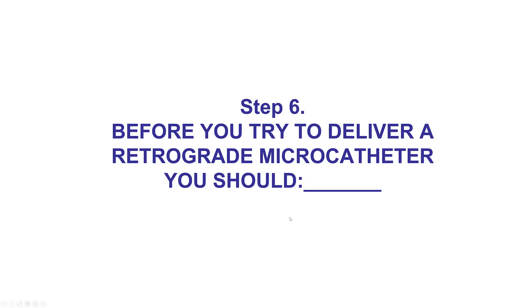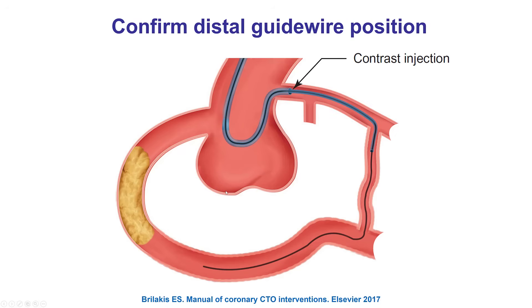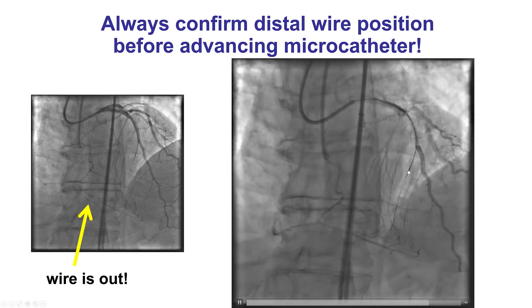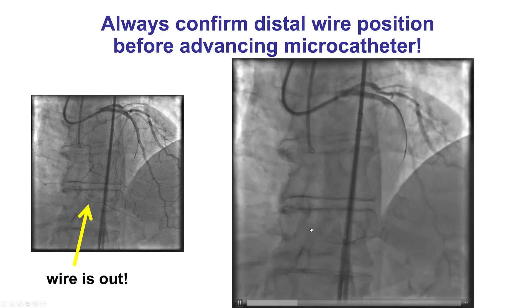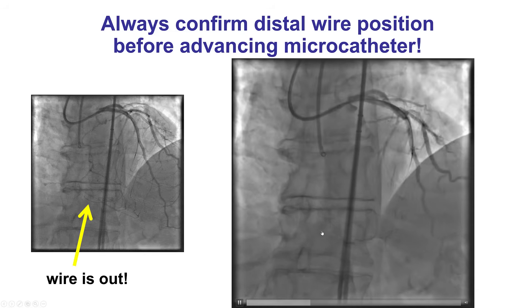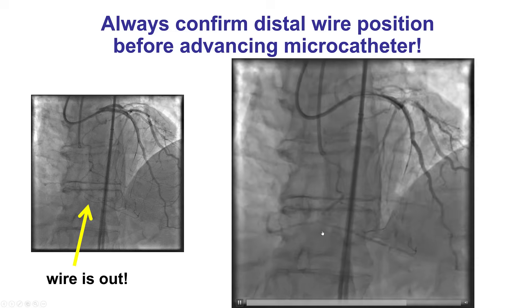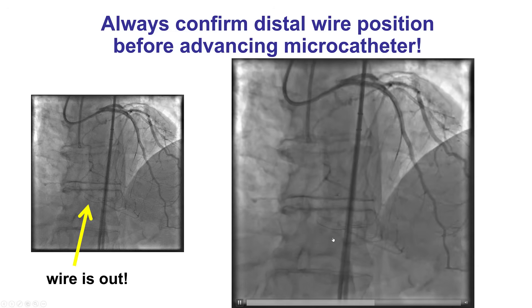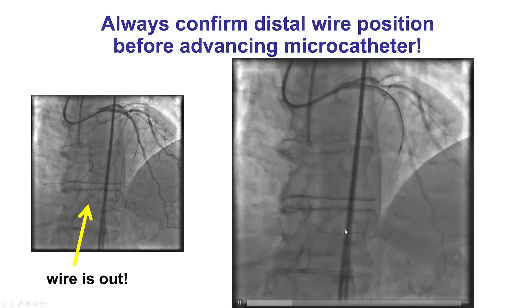It is very important, before doing anything in terms of delivering the retrograde microcatheter, to make sure that the wire has crossed from the collateral into the distal true lumen. Otherwise, this can result in perforation. This is an example where the wires seem to be in the true lumen; however, injection demonstrates that the wire is actually outside, possibly in a cavity or possibly into an epicardial vessel, and advancing the microcatheter when the wire is not where you think it is can lead to perforation.